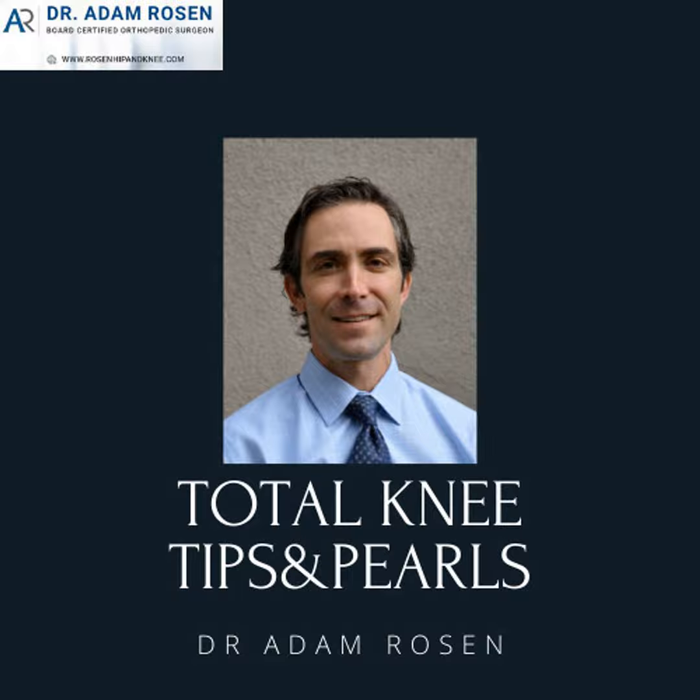But for a lot of revisions, even though you may have femoral tibial loosening or significant polyethylene wear on the tibial insert, usually the patella button is okay. But you can expose that more and remove that if needed or necessary. Now, one of the tricks that I use on my primaries, which I believe just helps tilt the patella up out of the way, is just releasing some of the tissue off of the lateral aspect of the patella. If you need to visualize it better, just basically untilt it. So while you're looking at it from above, you can see it. And then you can also tuck it in there.